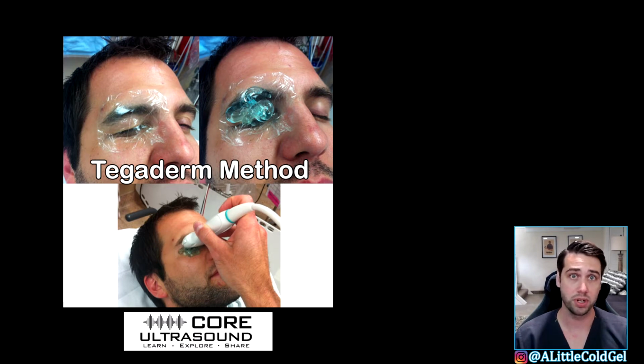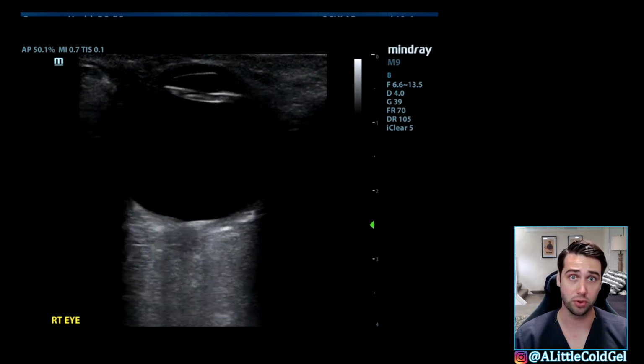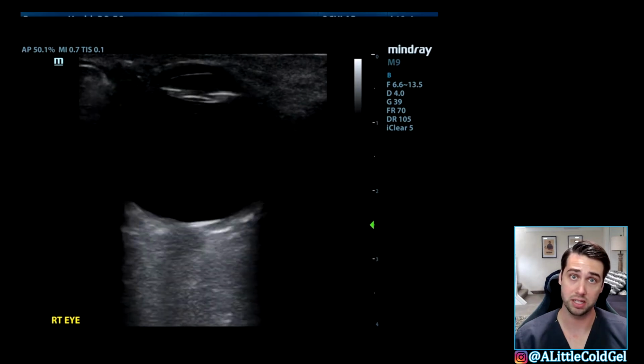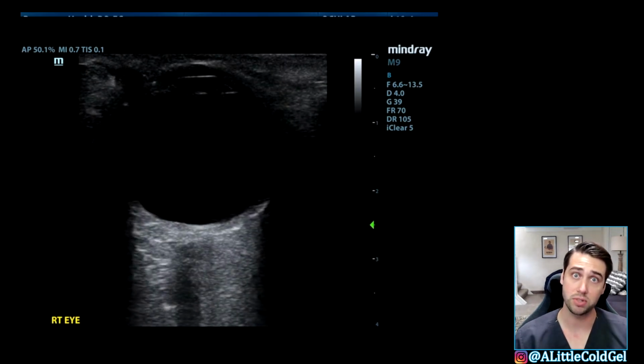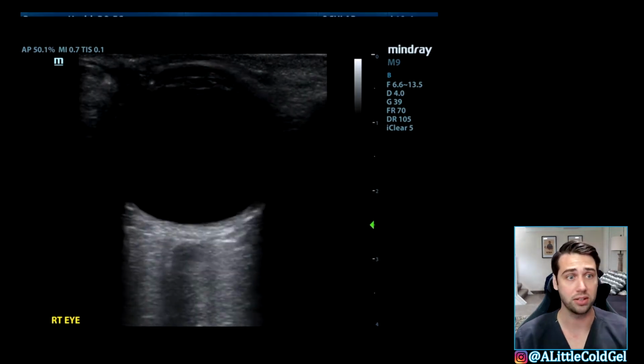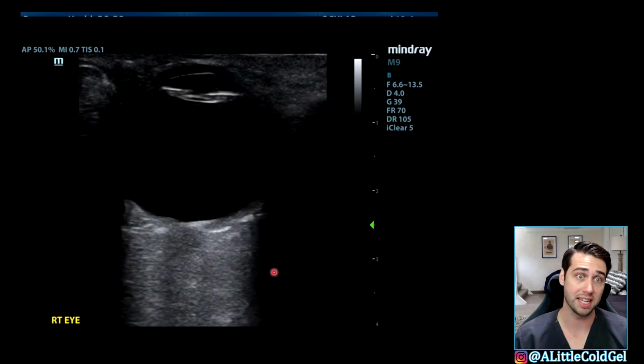So after you've put a sufficient amount of gel on top of that tegaderm, you're going to want to image the eye and make sure you get a nice wide view of the entire eyeball. So basically this is what you should be looking for. And the way you want to do that is fill that cavity area with as much gel as possible, and then lightly set the probe there and slide up and down in the area until you get a view where you can see the eye basically as big as you can.